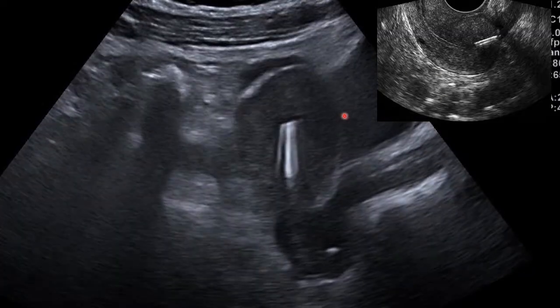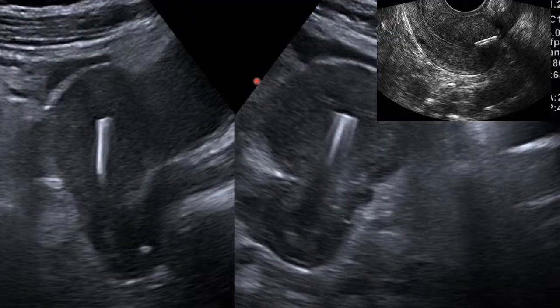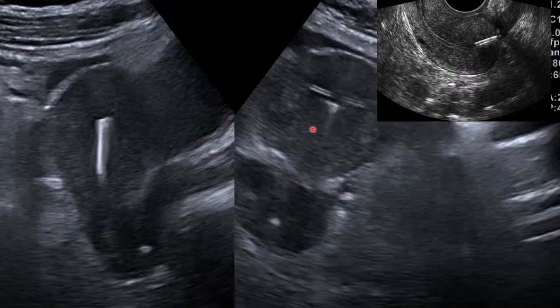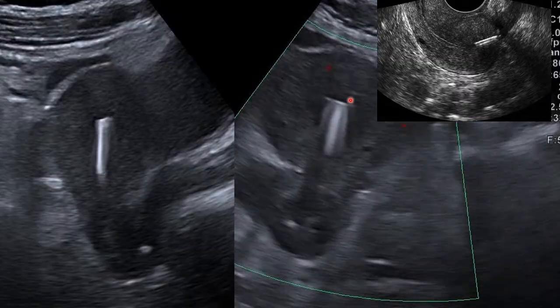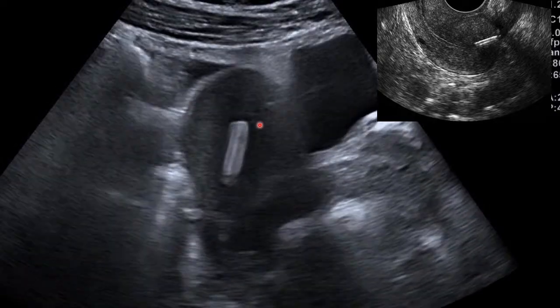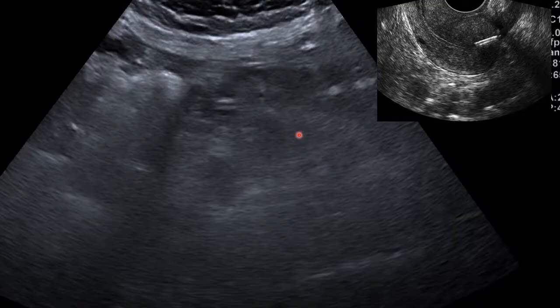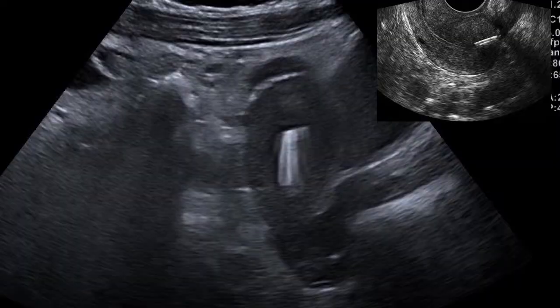So I really had to include this case in my discussion because it's not always the case that if there's pain, it is attributed to an intrauterine contraceptive device. But the knowledge and the history, for you that know that it is there, gives us a lot of leeway to navigate through. So we are navigating from multiple angles to see: is it the cause? Can it be the culprit, or is it not, or is it something else?